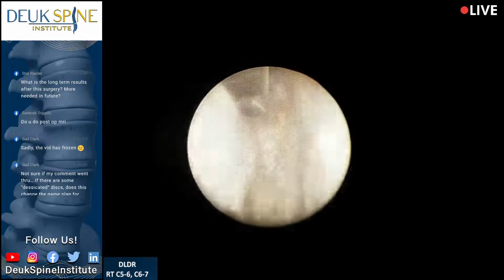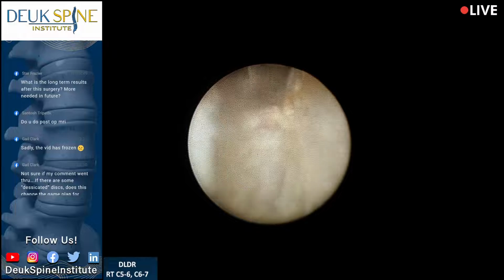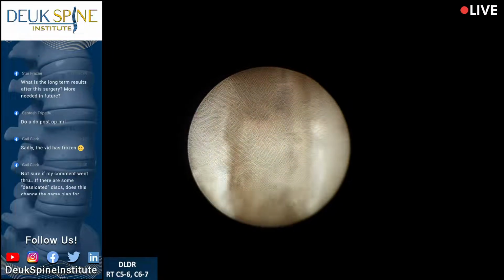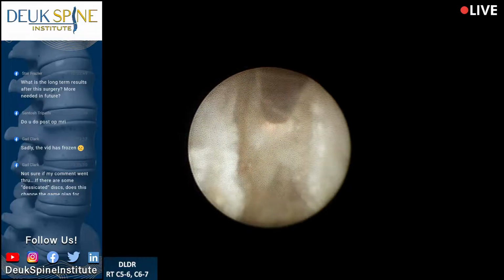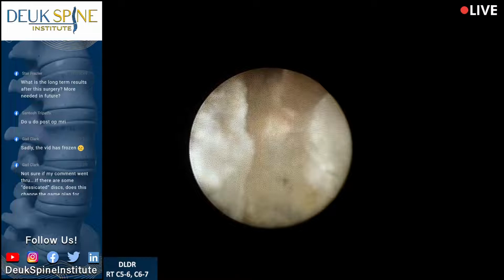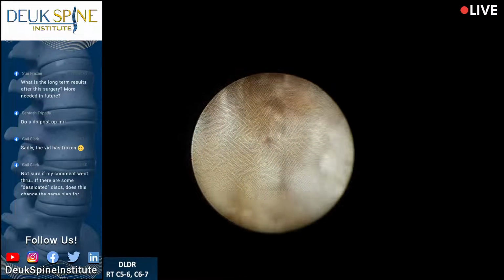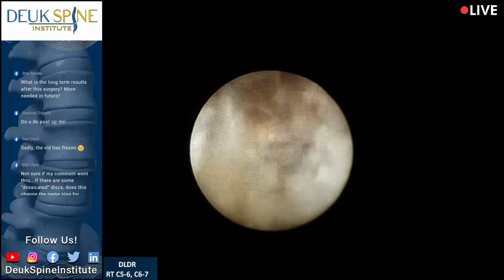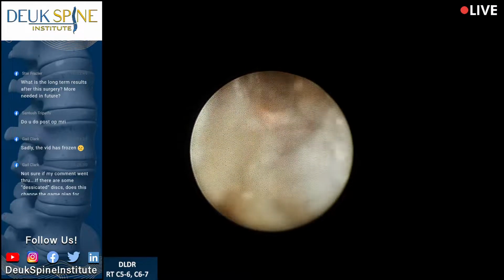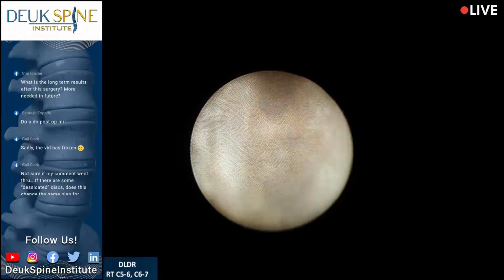This is what's called foraminal ligament. And you can see it's calcified. That's where that golden color is. It's calcium. And you can see the fibers of the posterior longitudinal ligament down there. We're not going to mess with them, but we are going to peel everything off above them because that's where the herniation is. There's some fibers. You can actually see a hole there in the PLL where the herniation went through. So I got to get rid of that.